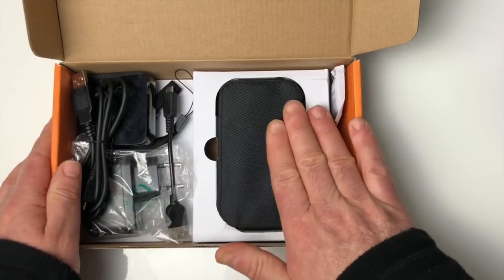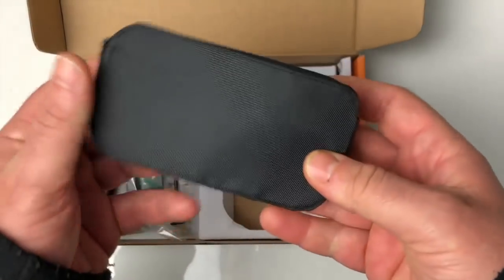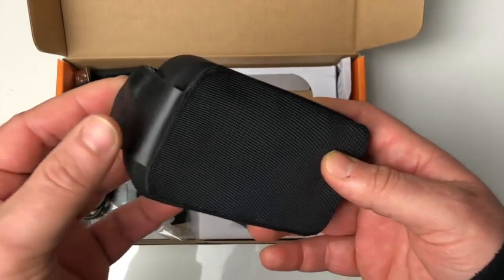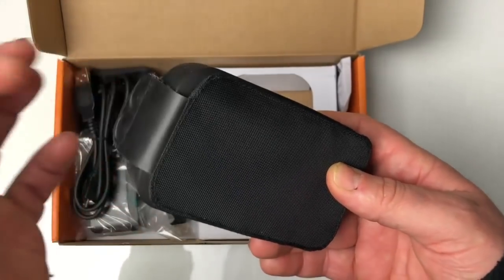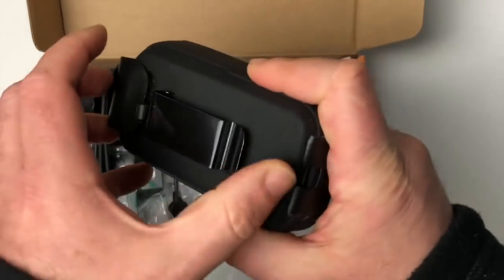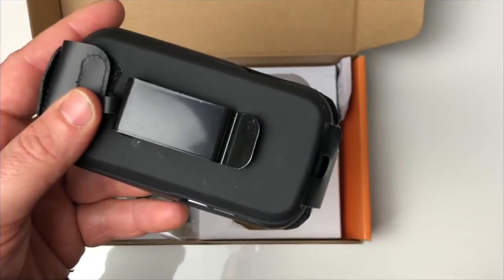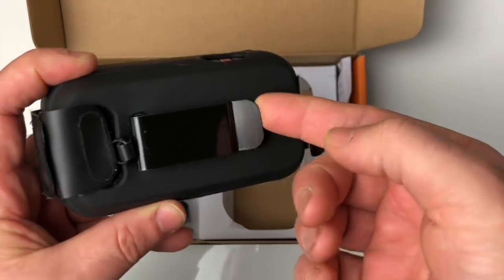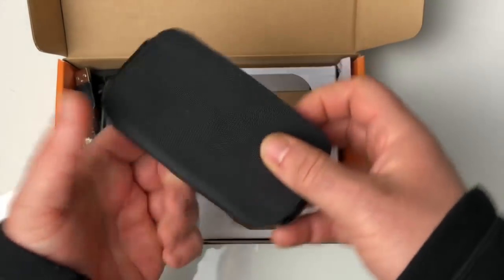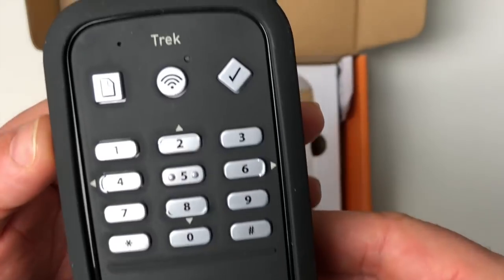La boîte face à nous, l'appareil se trouve à droite. Il est mis dans une housse en tissu avec un clapet aimanté — on l'entend. Derrière cette housse, on a une grosse pince pour mettre l'appareil à la ceinture ou à son sac en bandoulière. L'appareil sera donc très bien fixé par cette pince. Si on ouvre le côté aimanté, on tombe instantanément sur l'appareil.